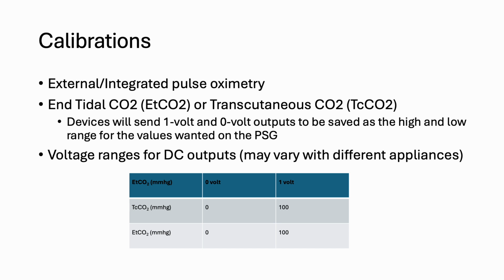A lot of the times these capnographs move from room to room when they're needed, and they have to be calibrated before you use them each time. In the end, follow your P&P manual. It will have a detailed explanation of how the provider wants the calibrations to be documented and performed.